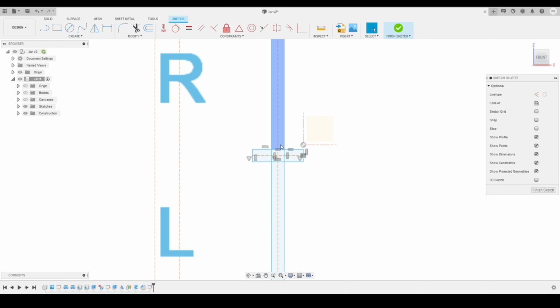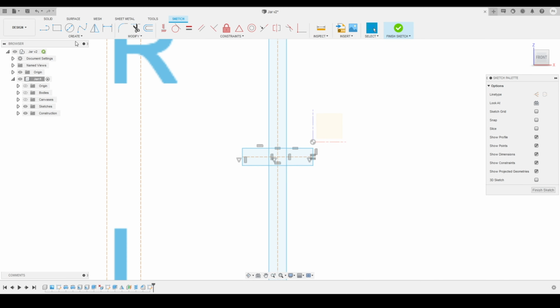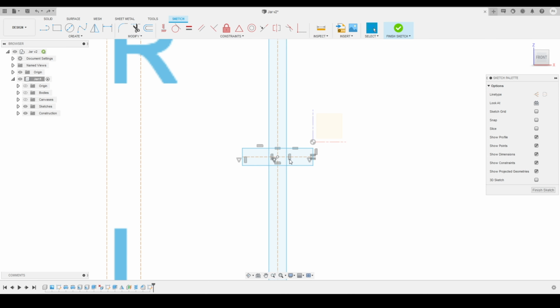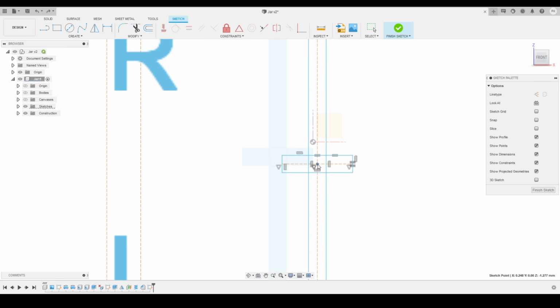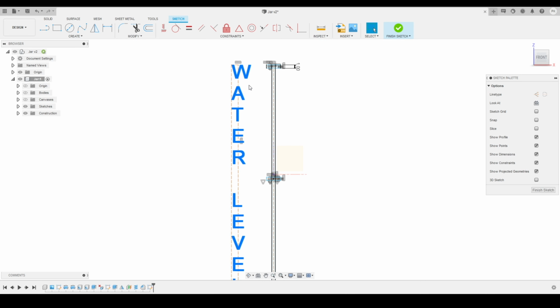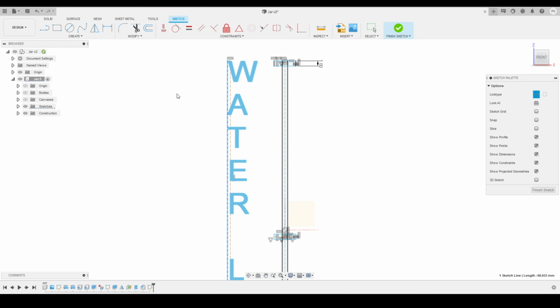So I will activate, go on to the create panel, activate the point tool, and make a point over here and make sure that these two are in the concentric position, same level. Here you can see, we will just make sure that these are on the same level in the vertical orientation. So we had moved it to the vertical position, then we had applied the constraint, so they are now on the same vertical position with the origin. Now if I turn on the bodies, it will look good for now.